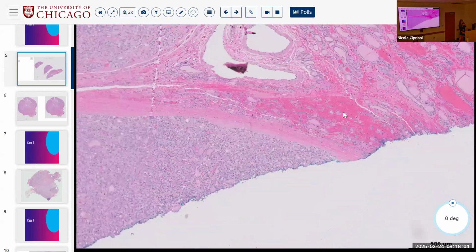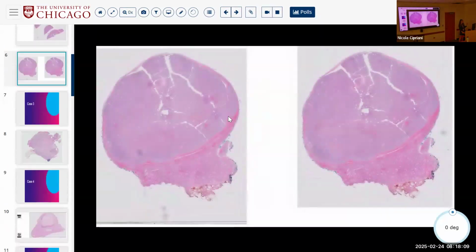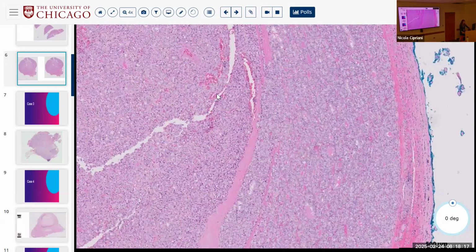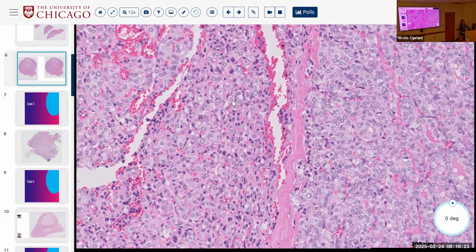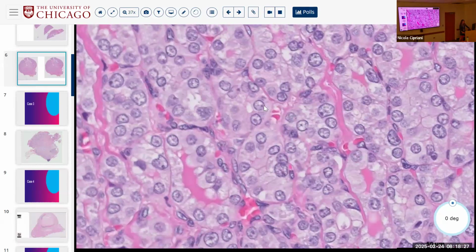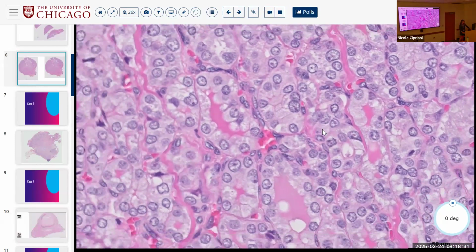I try not to get lost in the weeds of what's going on in the hemorrhage, but more like what does this overall look like? And so we have invasion in a follicular carcinoma, and over here we also have, again, the cap, but without the stalk. If you believe that this is the same as this, then you're money. And I think morphologically we can imagine that these are all pretty similar. You might again get into the weeds in terms of, all right, what kind of clearing is this? What kind of wrinkling is this?